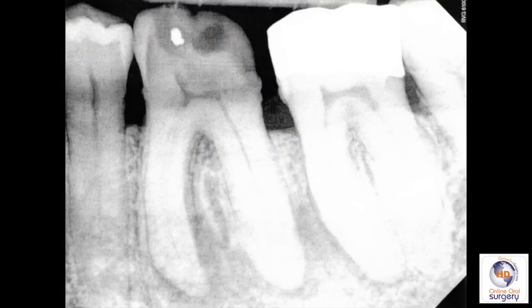Before we take the tooth out, we want to take another look at our periapical radiograph and see what we've got in store for us. You can see that there's fairly extensive decay in the crown, so there's always the chance that when you take the tooth out, the crown may crumble. But if you look at the roots, there's a fairly straight distal root that does not seem to be decayed, and the mesial root does have a little bit of a gentle distal curve on it. There's also some bone loss into the furcation and widening of the periodontal ligament space.